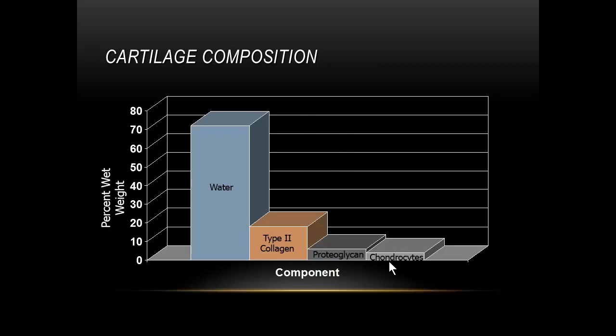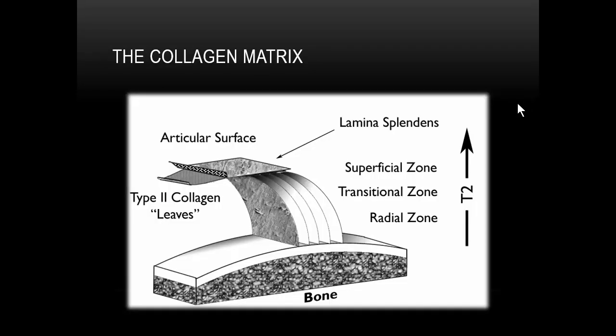But it points out the fact that none of these are chemical techniques. They are not specific techniques. We are manipulating the way we acquire information about water relaxation in order to probe different environments related to the collagen and proteoglycan. But ultimately, as these begin to break down, the specificity of those different relaxation mechanisms goes away. They begin to coalesce, such that there's not a lot of difference between one of these techniques and the other with more advanced degeneration.